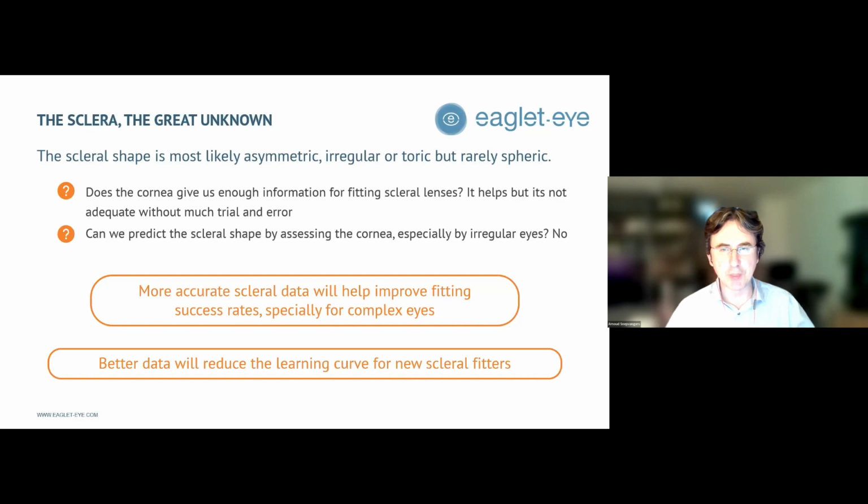But as soon as you get into more irregular corneas, like advanced keratoconus, then you just cannot extrapolate with sufficient accuracy to predict the scleral shape. So you will go through a lot of refits. And the whole idea behind corneal-scleral topography is that you can reduce those refits and you can focus on getting the best fit for your patients.